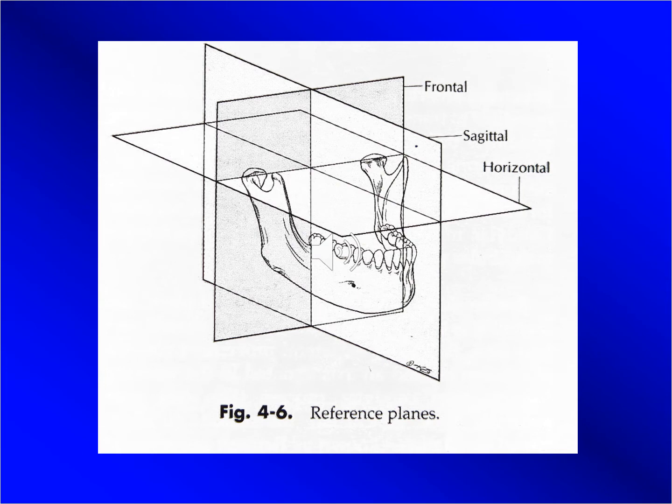Well, in comparison to the previous slide in which we showed that the mandible can open and close according to an arc that is determined by the location of the occlusal plane in relation to the terminal hinge axis, which is an axis that passes through the two temporomandibular joints' points of contact, or stationary points during opening and closure, also, the mandible can move in three-dimensional space.